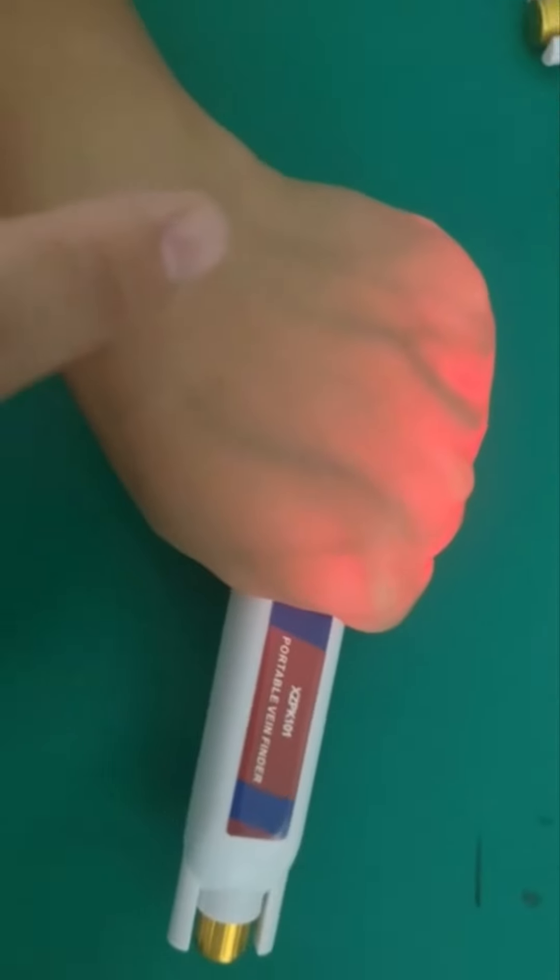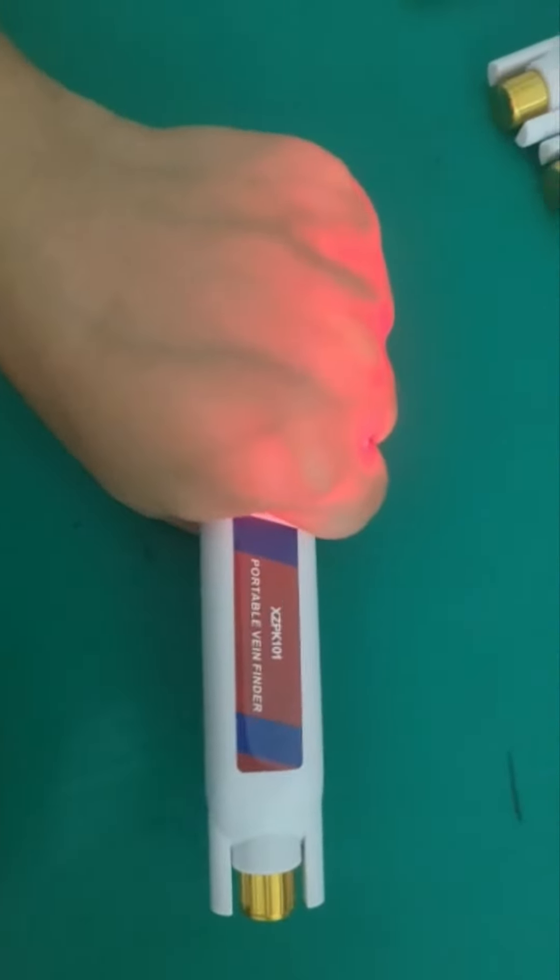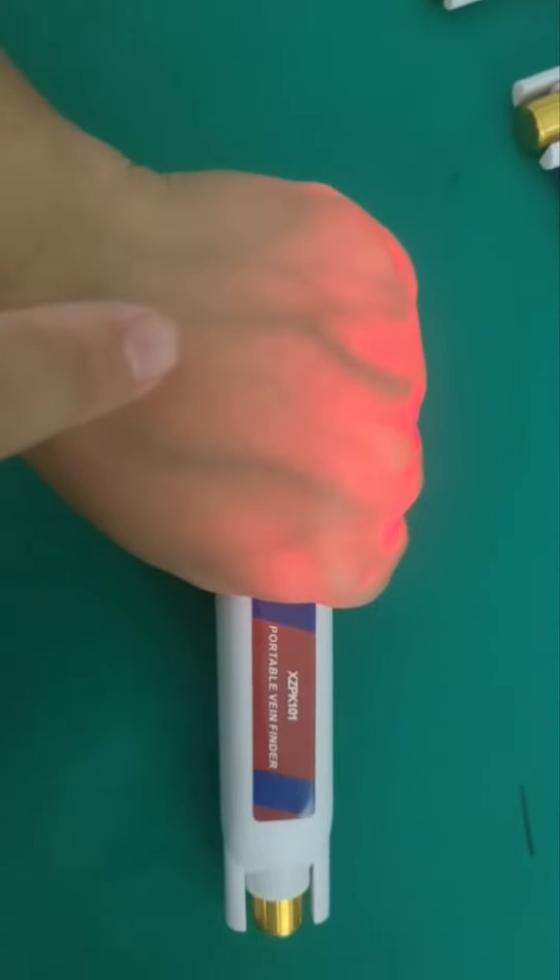In this case, it's okay. The device will not become hot. It is okay, no problem.